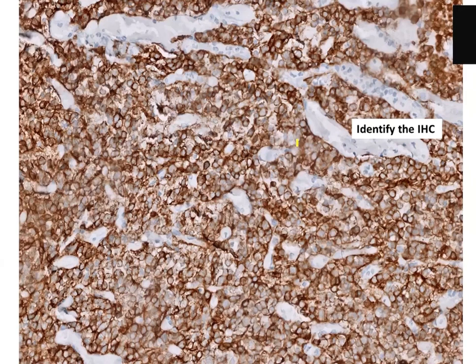It is membranous positive, strong, diffuse positive. So can be L1CAM. Yeah, there is nothing. Somebody says that it cannot be. No way it cannot be L1CAM. It can be L1CAM. So this is an L1CAM antibody, which is positive.